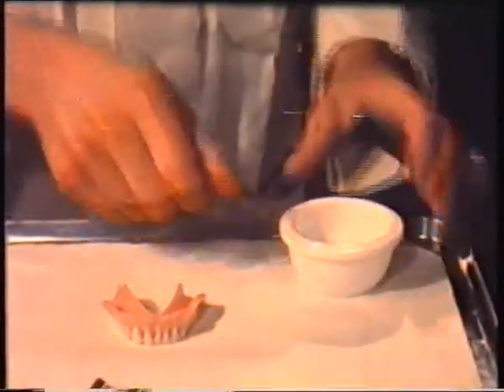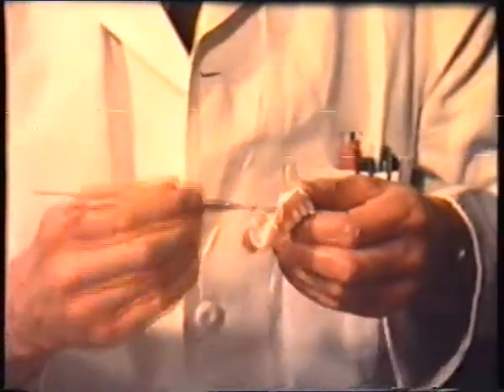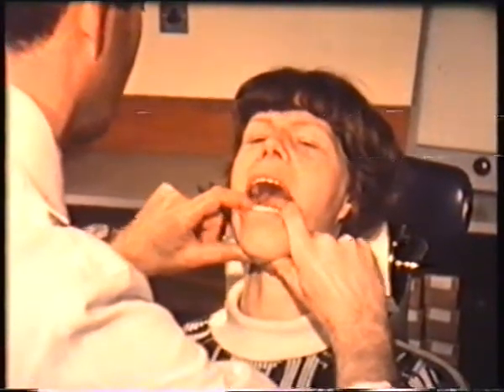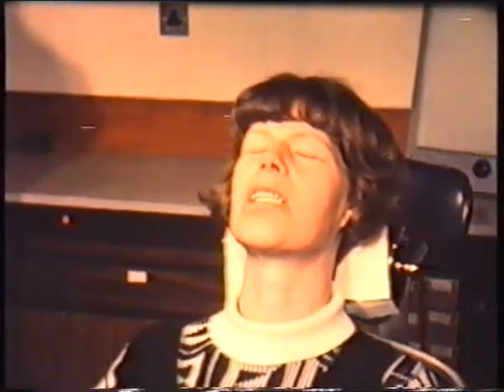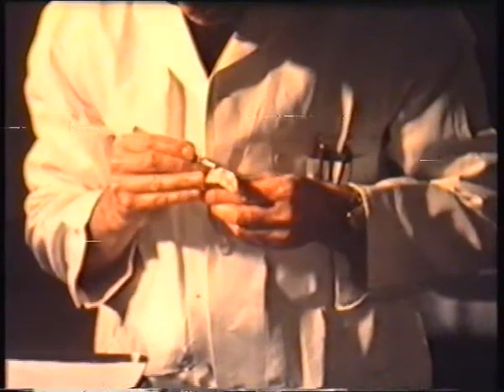The recommended treatment is to apply a functional impression material to the lower denture. This is placed in the fitting surface, and the denture is seated under occlusal pressure. Any gross excess impression material must be removed from the flanges and peripheries before the patient wears the modified denture for 48 hours.